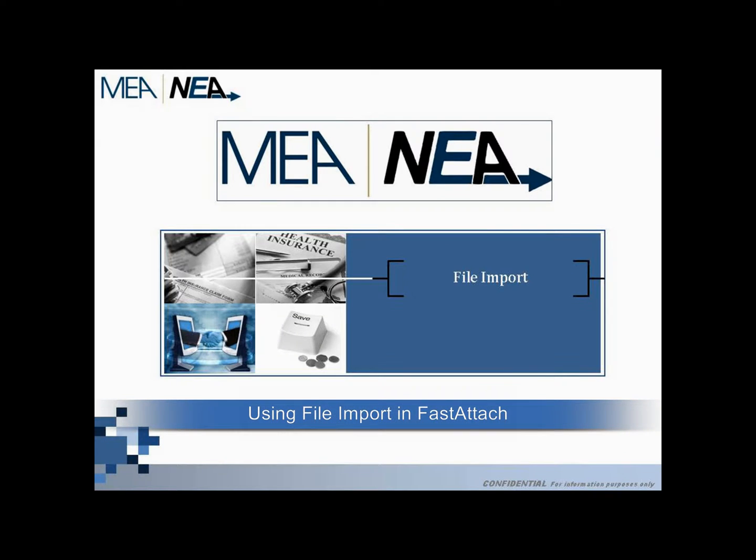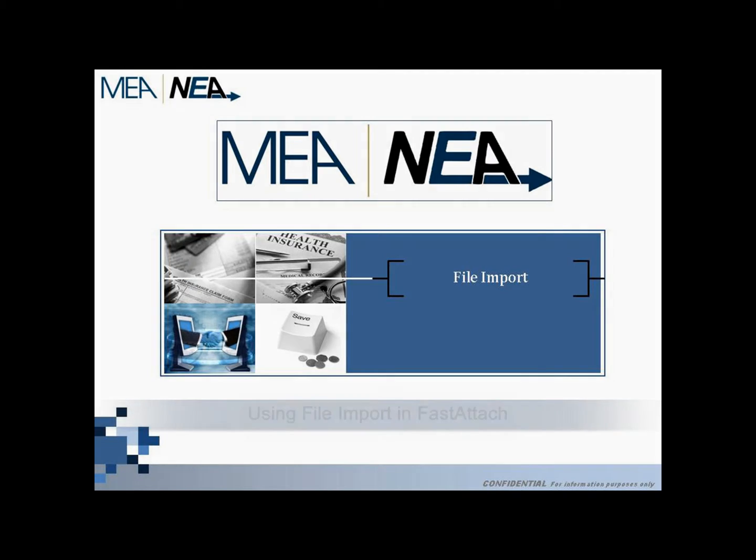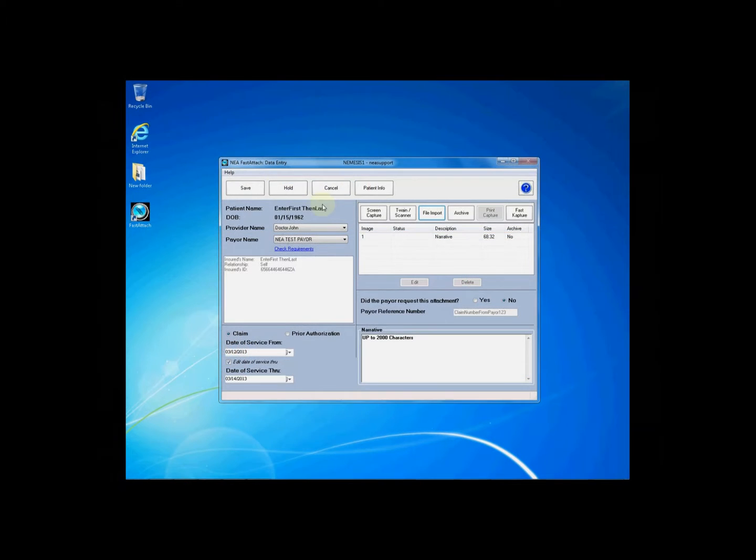Using File Import in Fast Attach. This video instructs you on how to use the File Import option in Fast Attach to acquire your x-rays and documentation.